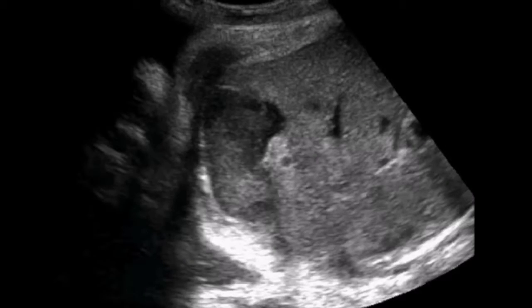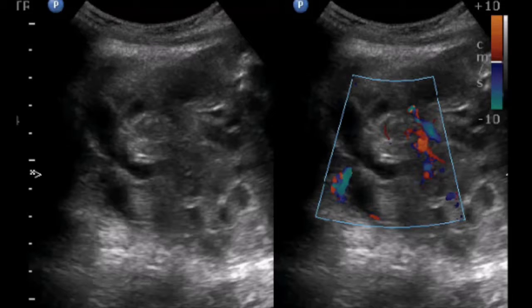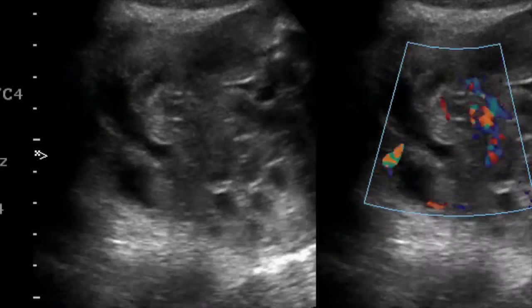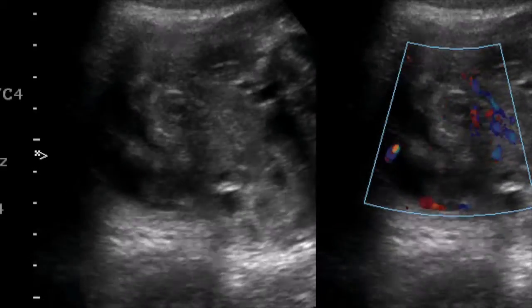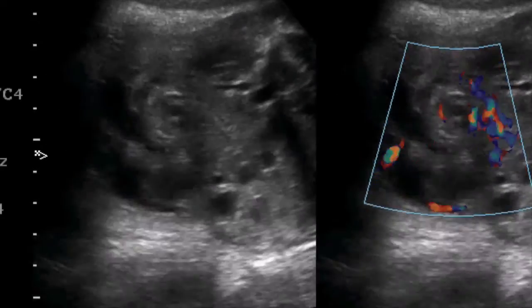On the colour Doppler, as you can see here, there is vascularity seen in this twisted vessel. These dilated loops are seen very well. This is another video which shows similar findings, and you can make out the internal echoes very well, the thickening of the bowel loops, and the echogenic bowel loops.